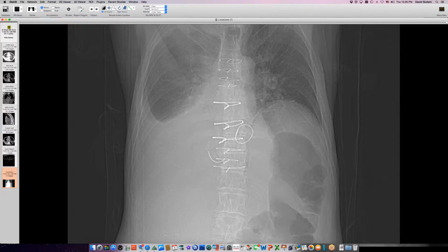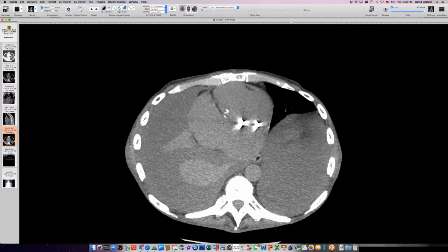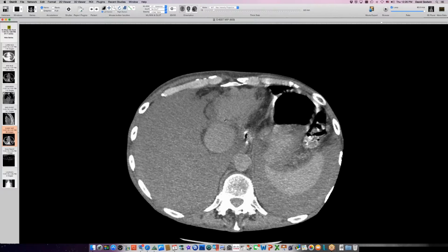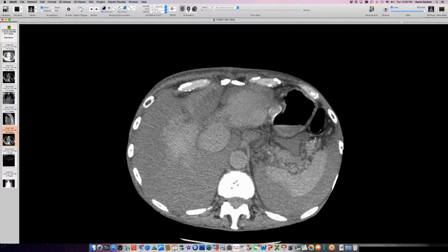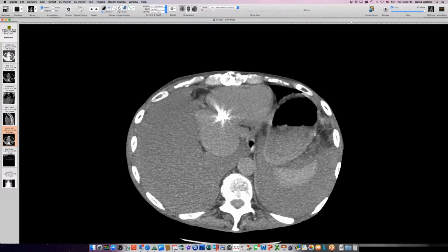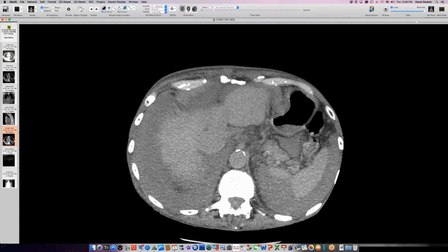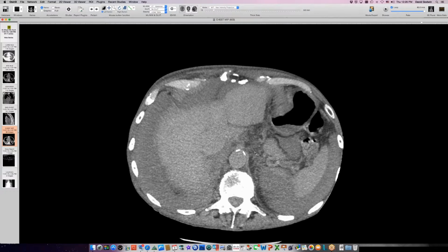So if we look at other imaging on the same person, we look at the cross sections for crus thickness down here, since I was asked to do fluoroscopy of his diaphragm, I always check the available imaging on this guy. And if we go down here, we have some thinning of the crus, but when we get to this point, we see there's actually pretty good crus thickness up here on the left. And I can show you this in coronal.